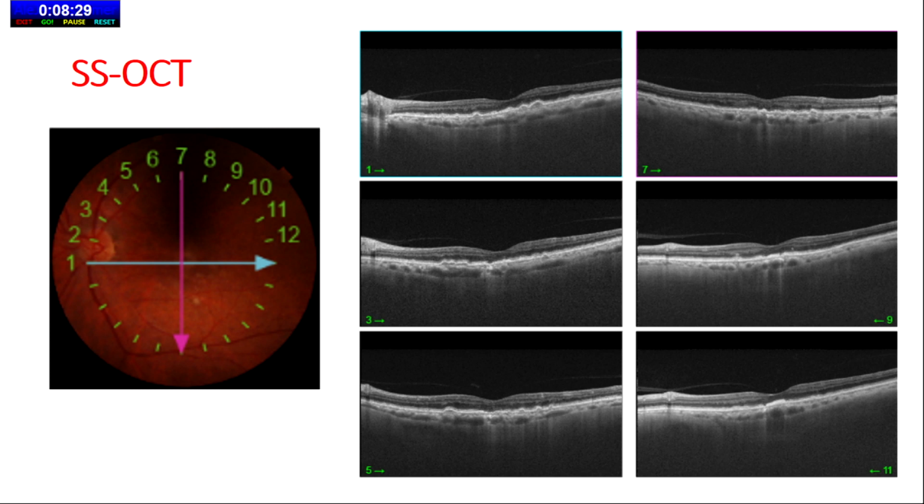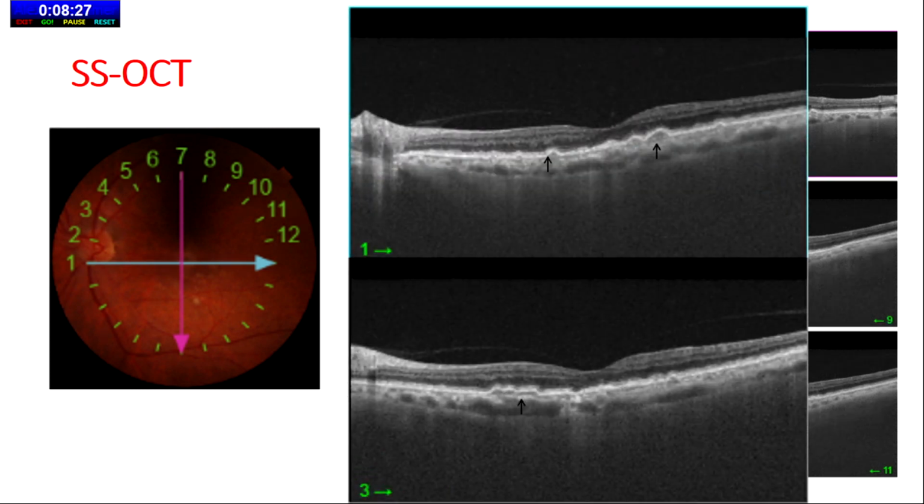It's not exuding, right? So whatever we did for the right eye, I'm not going to concentrate on that. This is talking about the left eye. That's a blown up of the same. You can see those arrows are just showing you the double layer sign. The retina was dry, both within, underneath, and below the RPE. And that's how the patient remained.